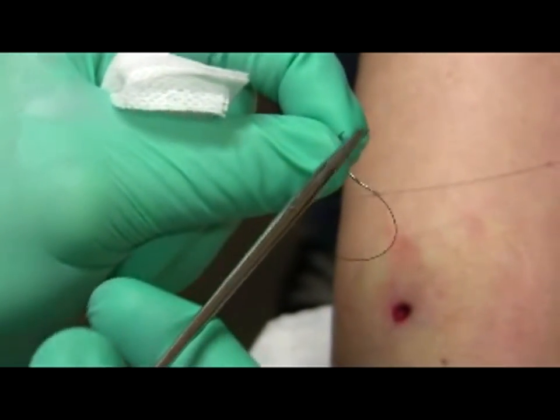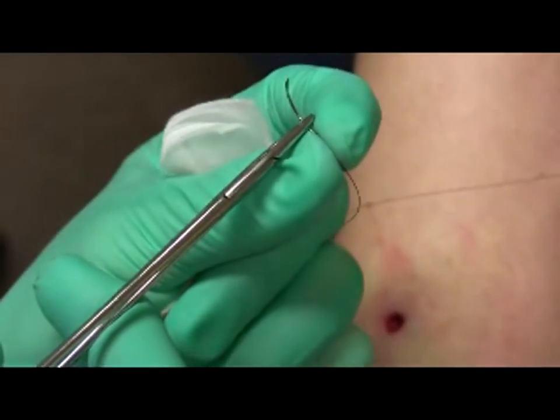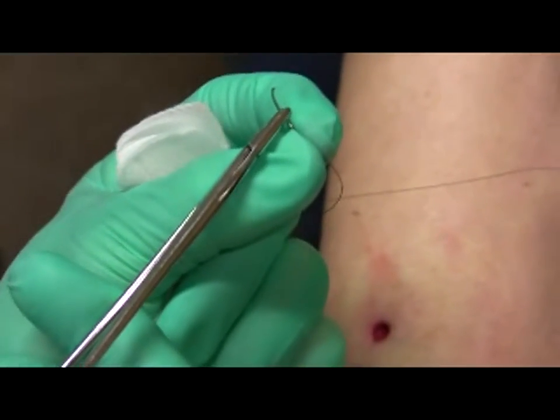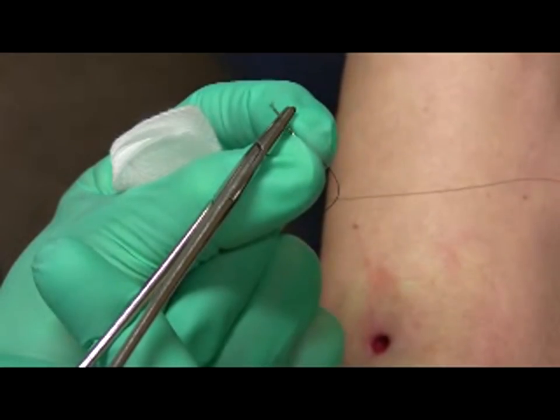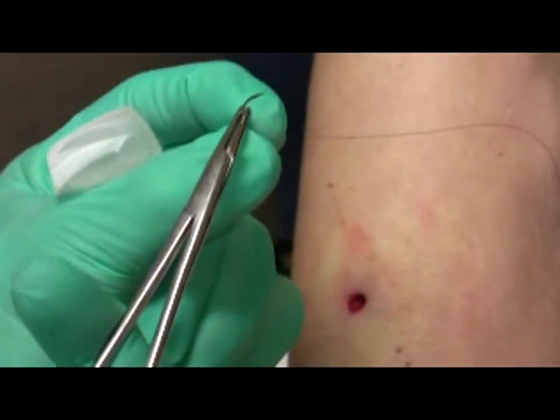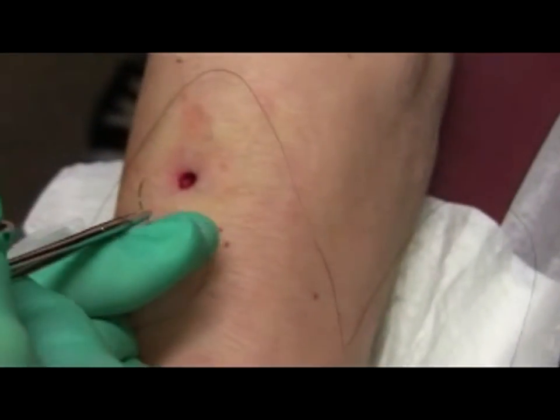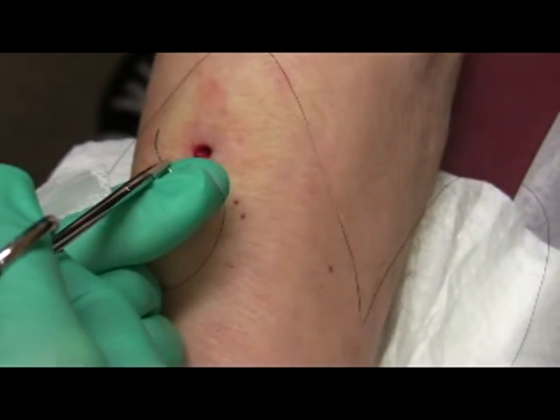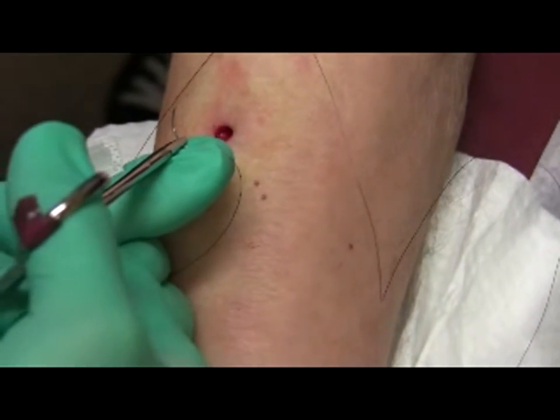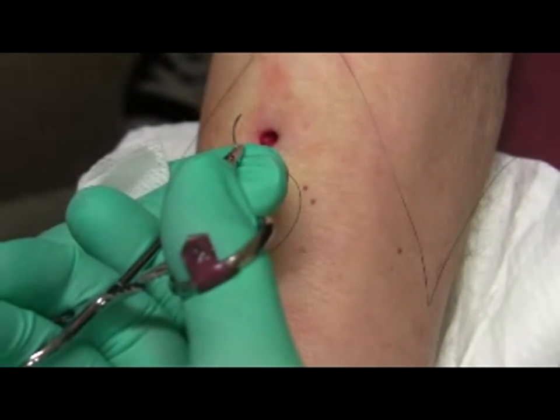Some people grab the needle this way to adjust — that's bad because you'll stick yourself. You always handle it from the end. Grab the needle beyond your thumb and index with the needle driver such that it comes between your thumb and index and the needle point. The needle driver should rest two-thirds away from the needle tip. It is okay to hold the needle driver with your fingers through the loops, as done with scissors — though some disagree, noting there is a greater chance to twist the needle.